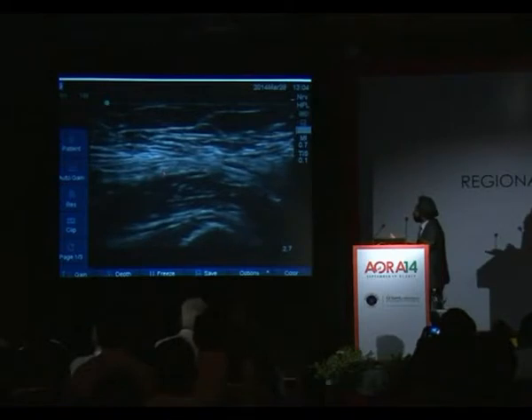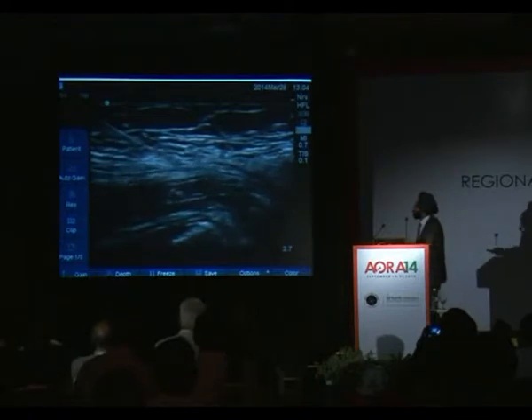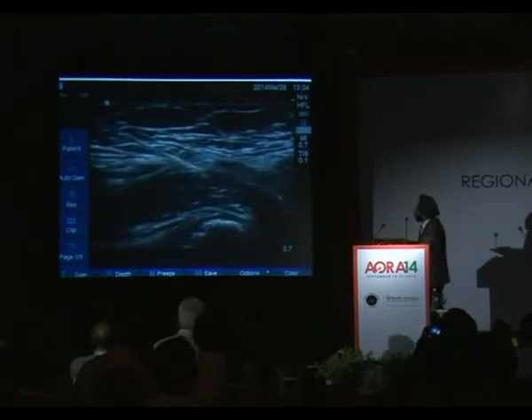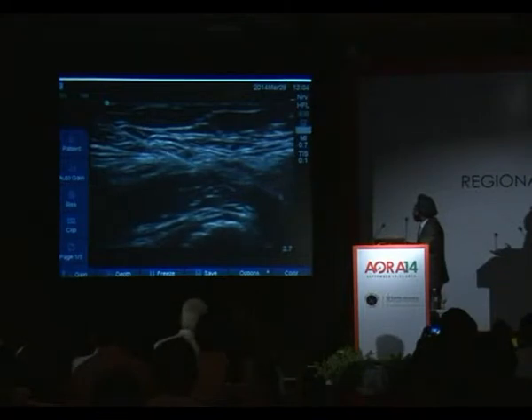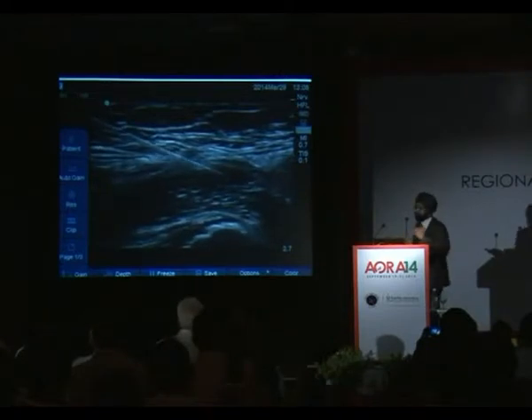When we come here, we're going to pierce the fascia iliaca. As it is a fascia, you will feel a definite give way when the needle is piercing the fascia. The needle normally would tend to move a bit further, so I would normally retract it by a couple of millimeters. Just give 1 mL of local anesthetic, and this is what happens.